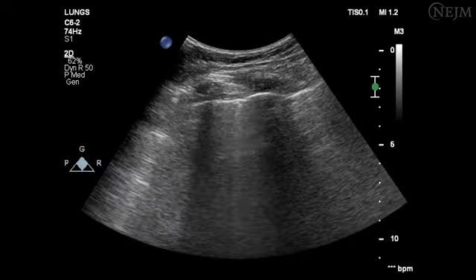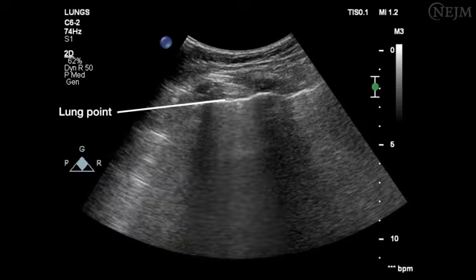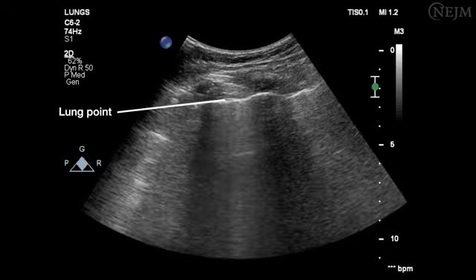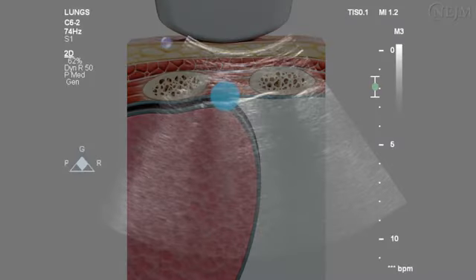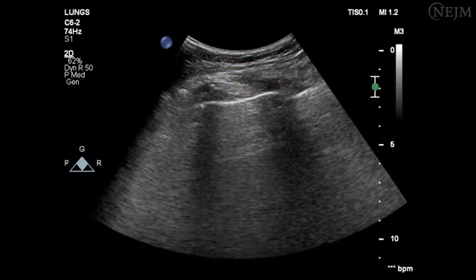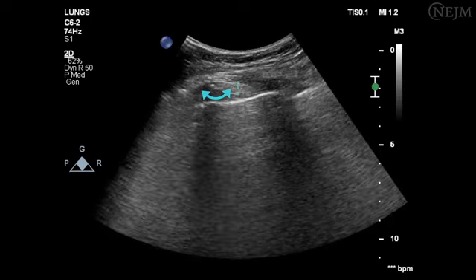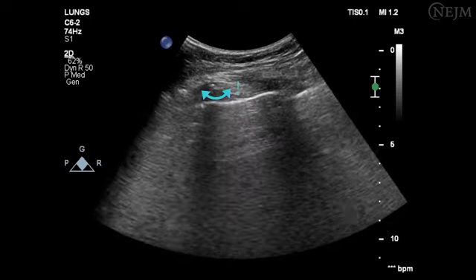Of the ultrasonographic signs of pneumothorax, the only pathognomonic sign is lung point, while the others represent additional features with low specificity. Lung point is defined as the point at which lung starts and the pneumothorax ends. This occurs when the lung appears suddenly and transiently on the ultrasound image. Thus, pleura with pleural sliding can be seen on one side of the lung point, and on the other, the sliding is not visible.